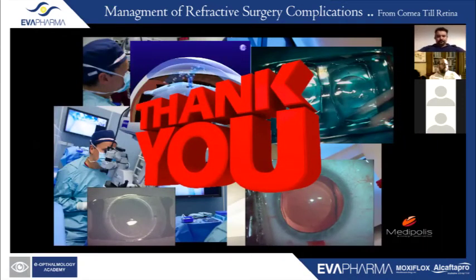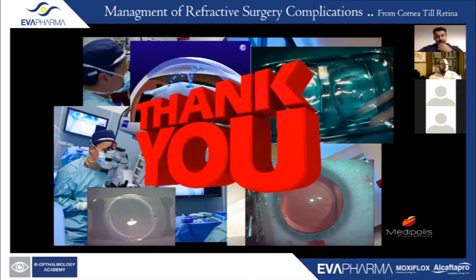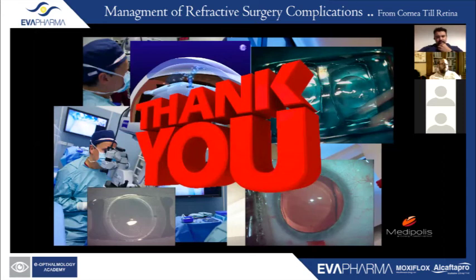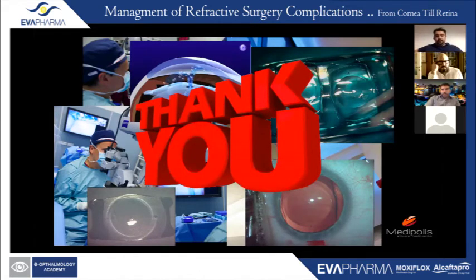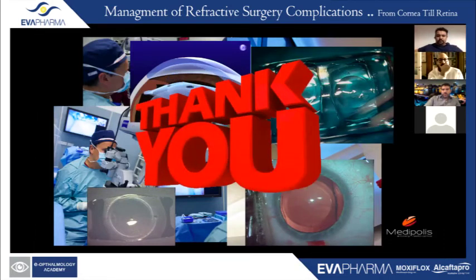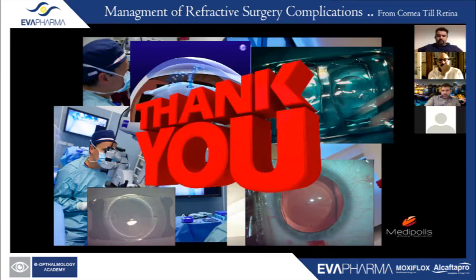Thank you, Eric. It's a very elegant presentation. And I like the way you remove the ICL from the eye. Is it easy like this? Do you first inject OVD under the ICL, or you don't inject? Yes, and you just elevate the ICL and make it touch the lip of the wound and act as a pivot, so you remove it like this. Perfect. Exactly. You explained it perfectly, Ashraf. Yeah, this is the way.